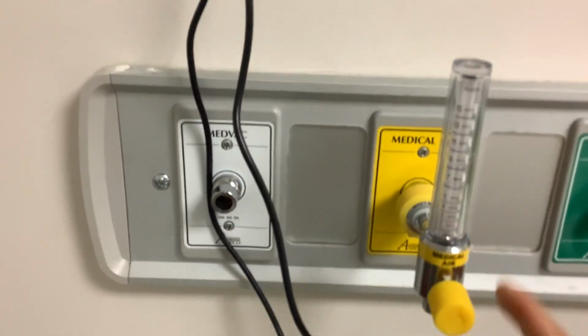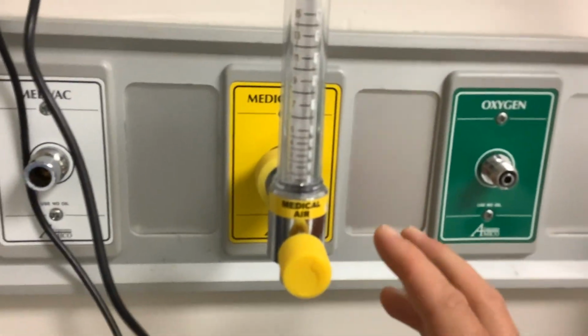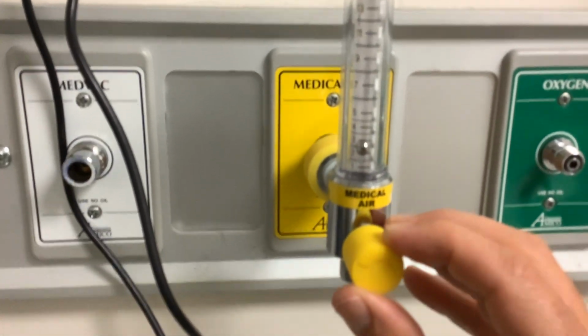But one thing I want to show you is when you're reading a flow meter, whether it's an oxygen or an air flow meter, you're going to need to turn the needle valve open, and now you can hear flow coming out.